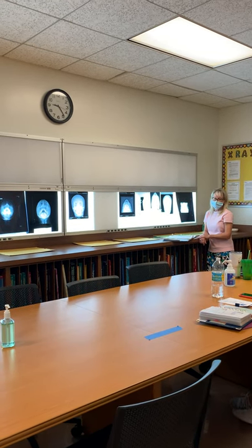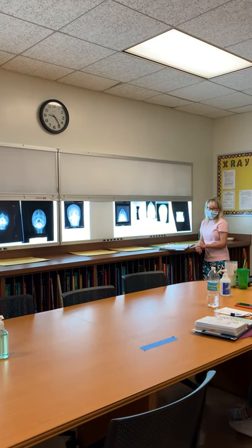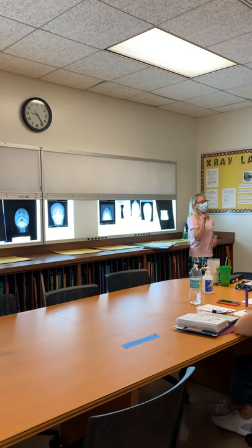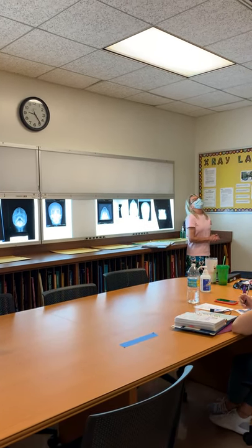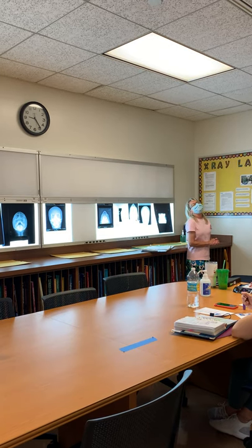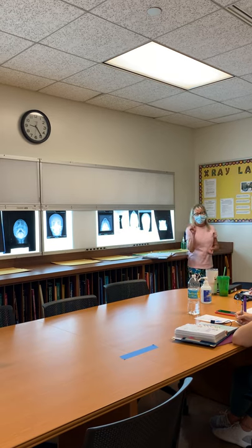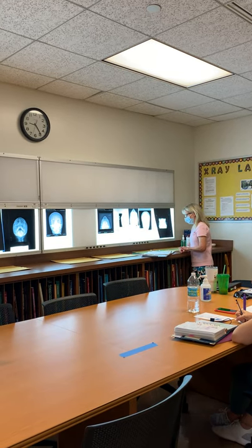Okay, so all you do is have them in the SMV position and then rotate whatever side you want to see, and it's just slightly. Rotate the side of interest 15 degrees towards that side. So a lot of times they just do both. Okay. So you're rotating 15 degrees toward the side of interest.